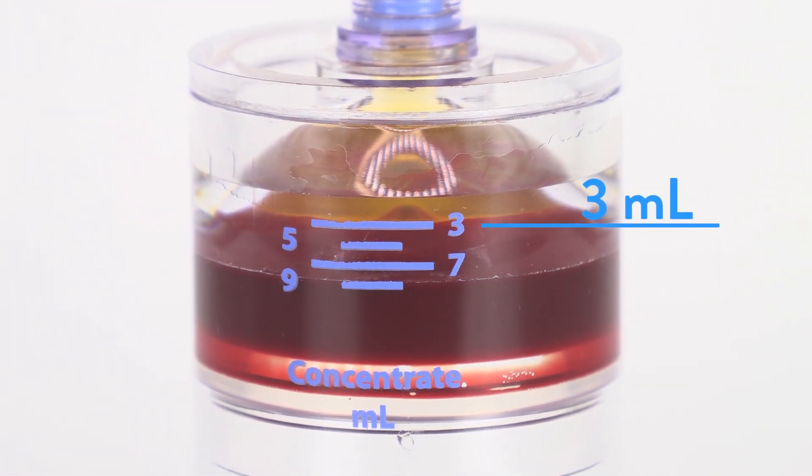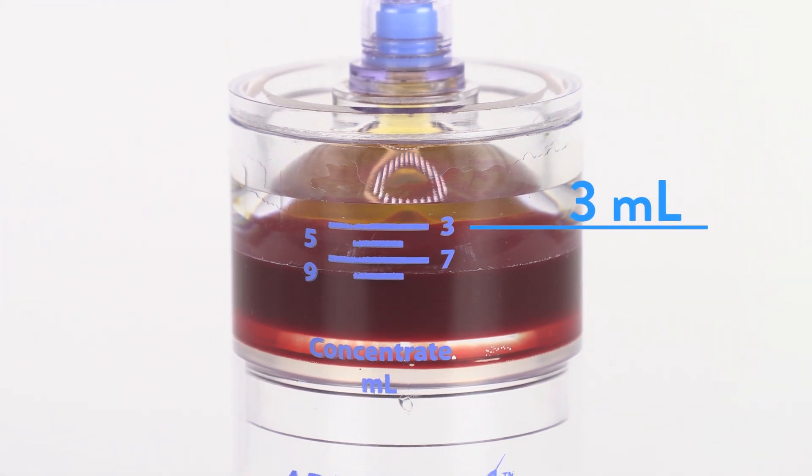Aspirate until the red blood cell interface reaches 3 milliliters or the desired volume marker.